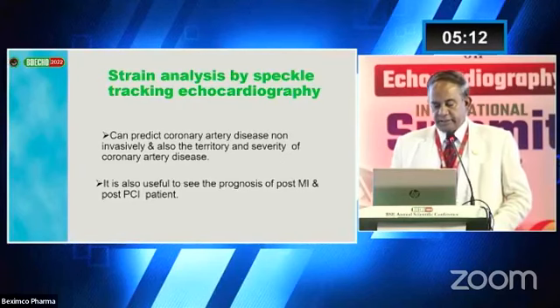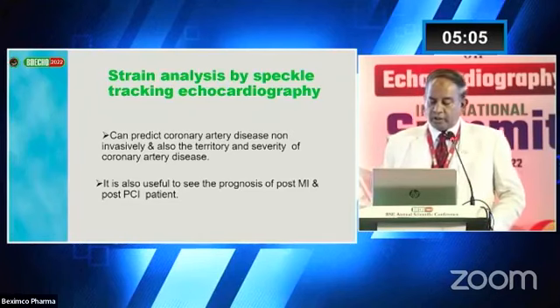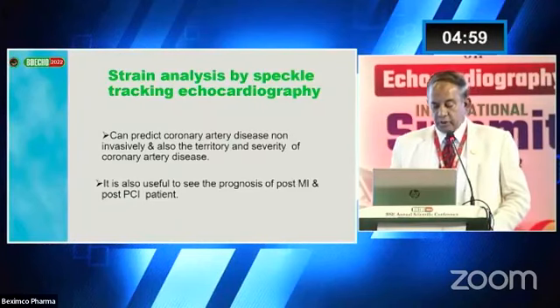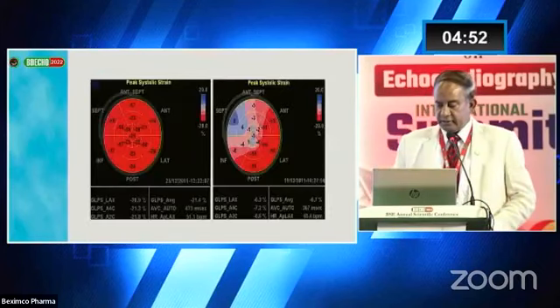Strain imaging is another modality, already mentioned by my previous speaker, but in intervention it can predict coronary artery disease non-invasively, as well as the territory and severity of the coronary artery disease. It is also useful to see the prognosis of post-MI and post-PCI status. This is the strain.